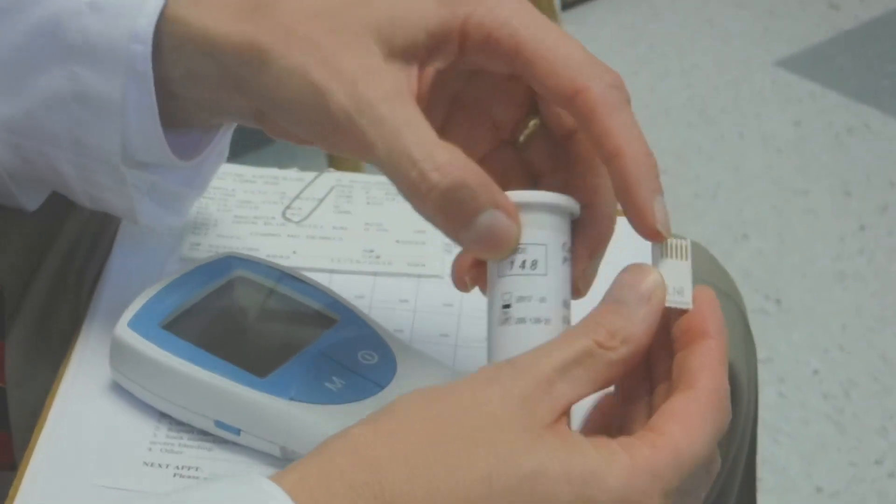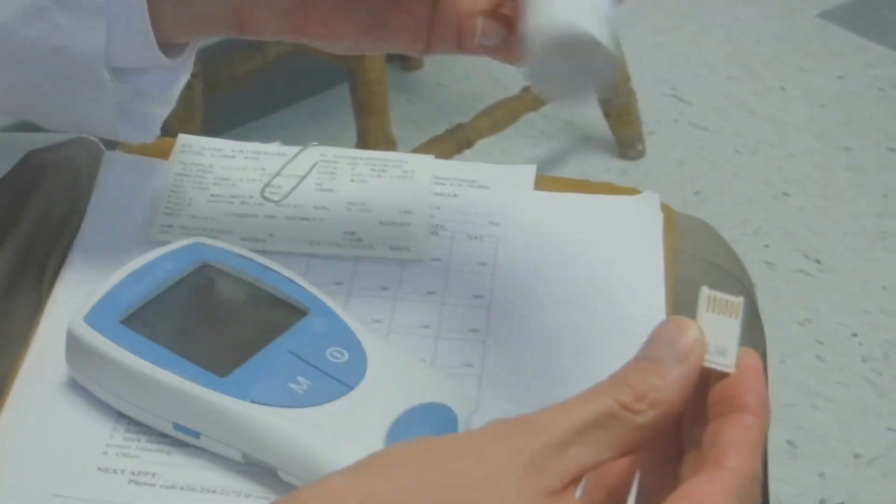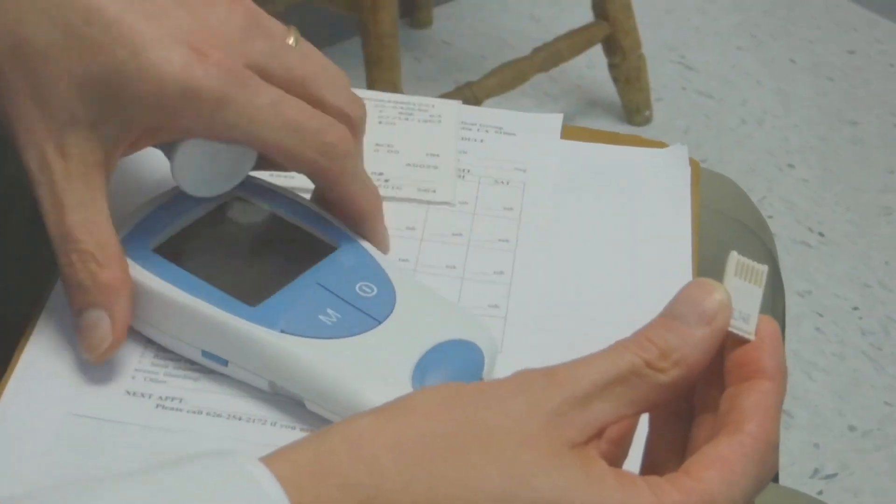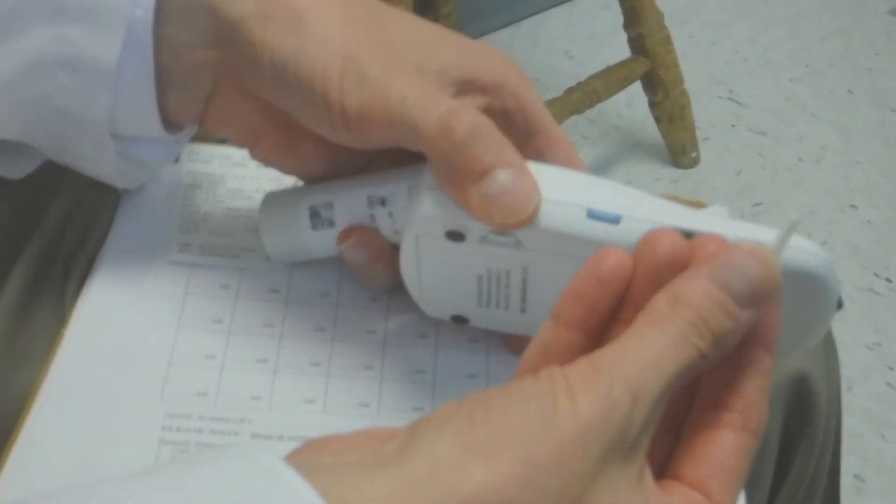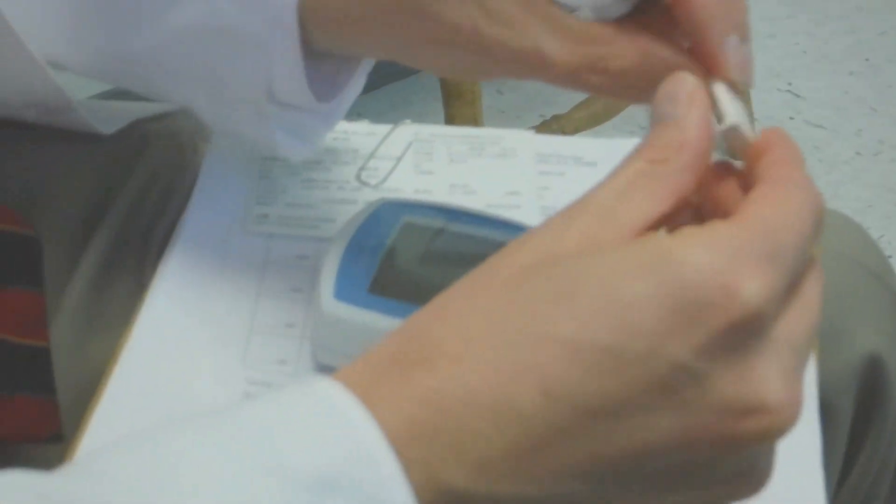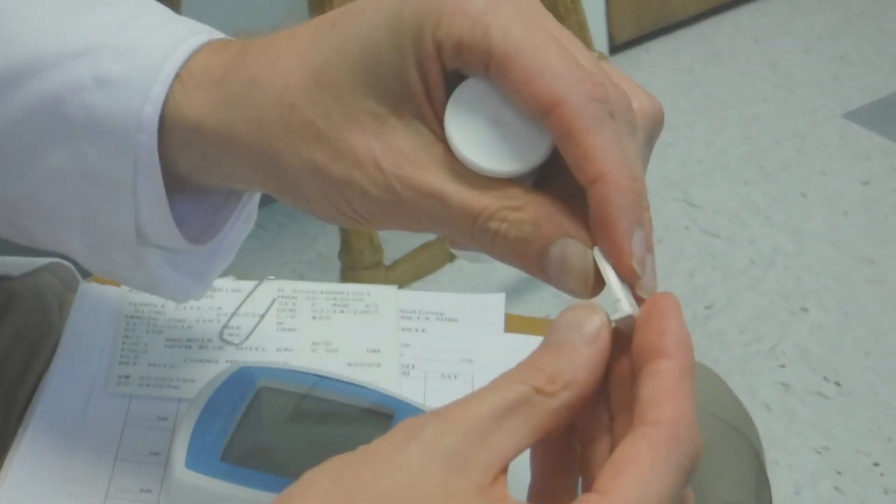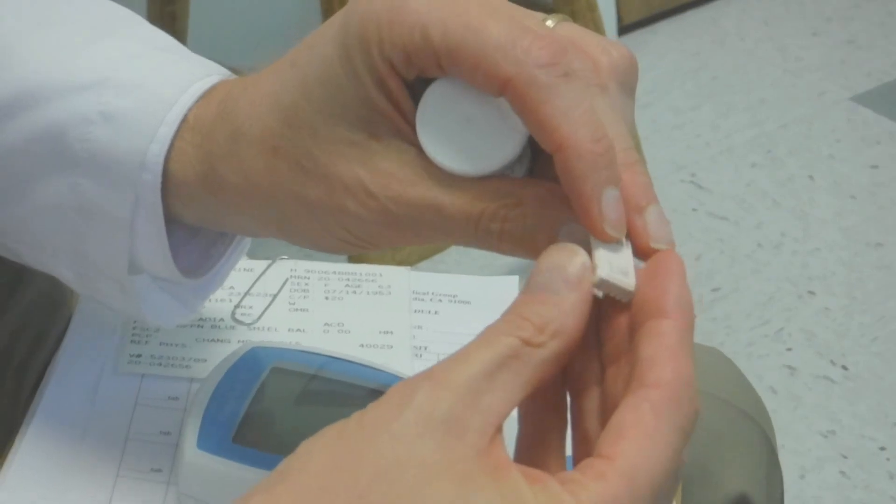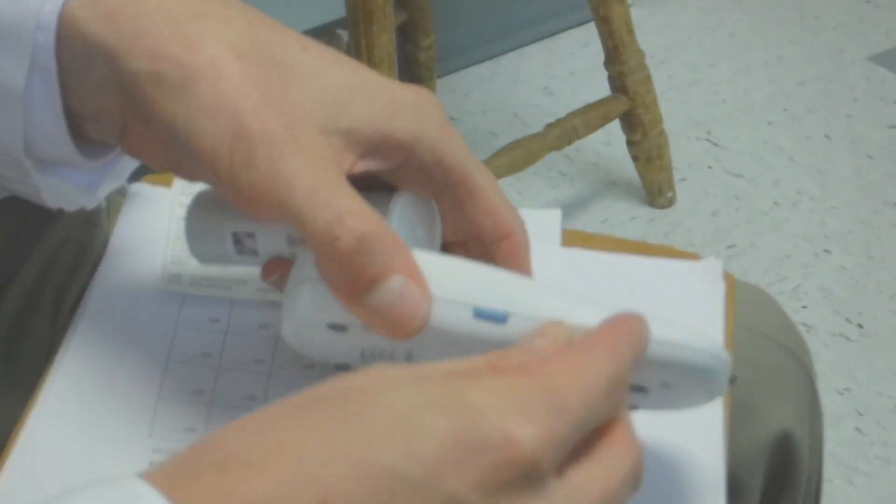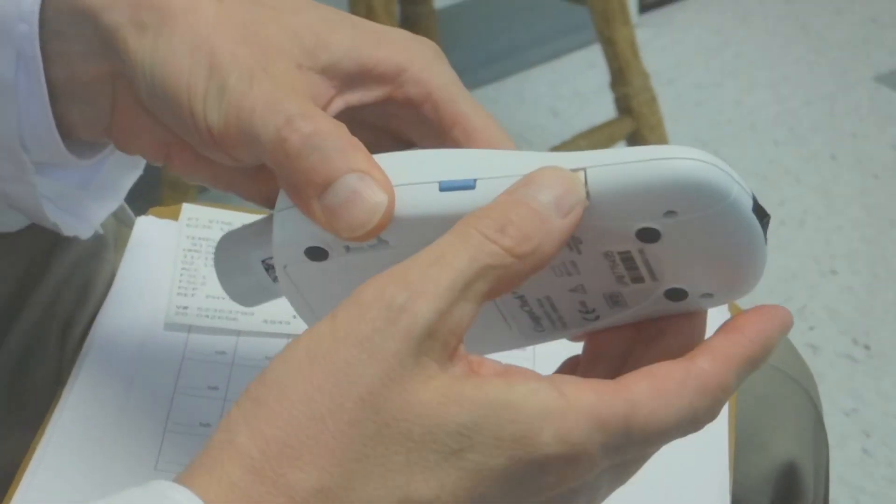The code is imprinted on the chip, so you want to make sure that's the same. And that goes, so it's almost like a backwards L, with the numbers at the top, and that slides in.